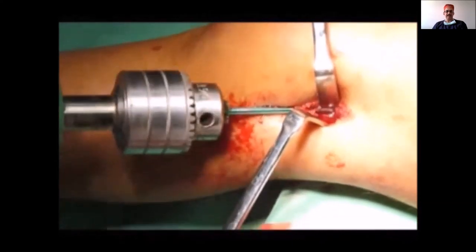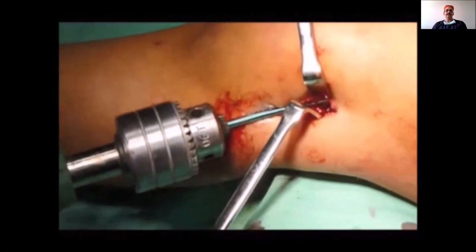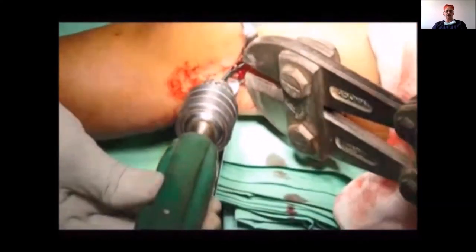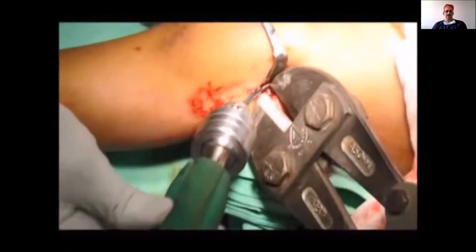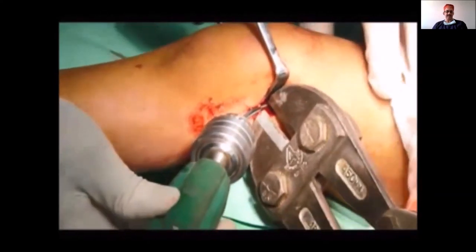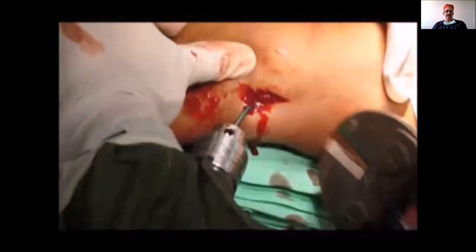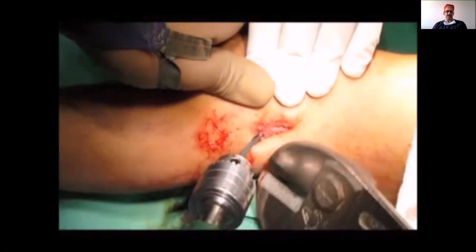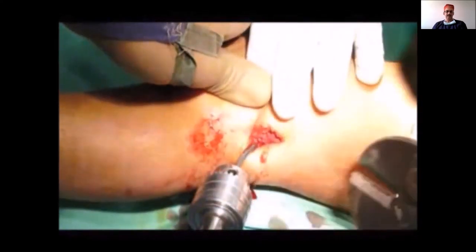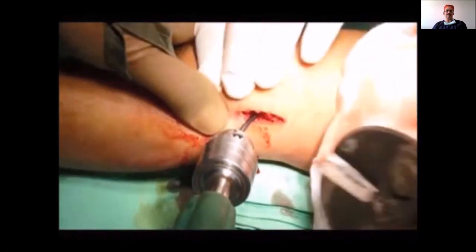After gentle final seating, once you know the seating points, withdraw the nail about one centimeter so you can cut it. Use a big Harrington rod cutter or a special tool if available. Cut the nail such that about one inch remains outside, flush with the lateral cortex.